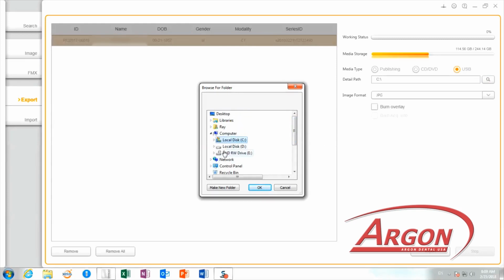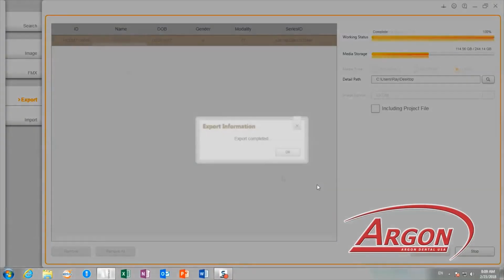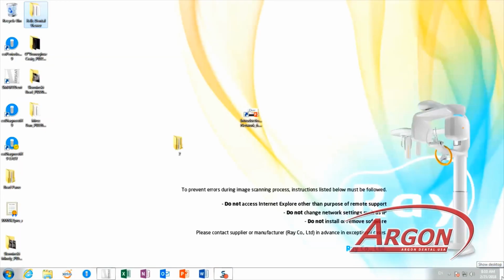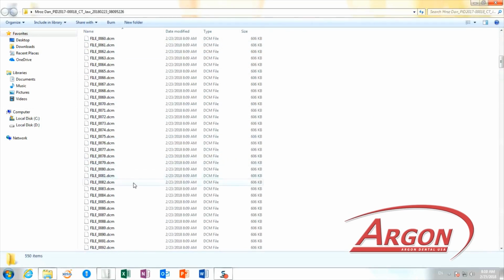In this case, we're just putting it in our desktop and selecting the DICOM file. Once the export is complete, you can check the folder. And you will see that you will have all the individual DICOM files, in this case, over 500.